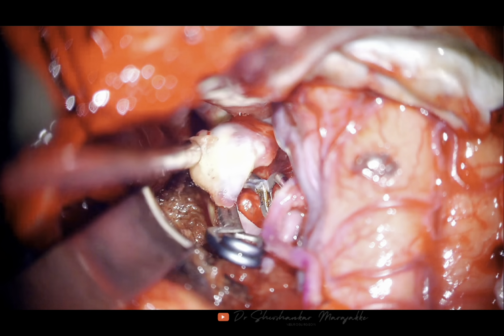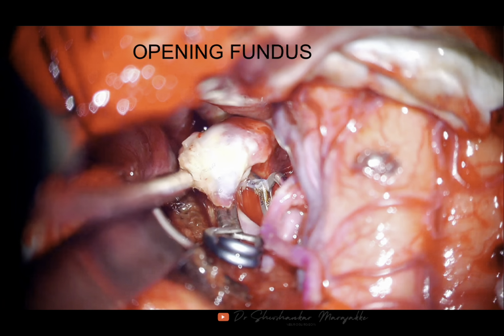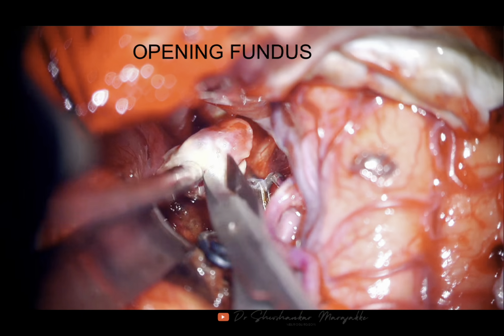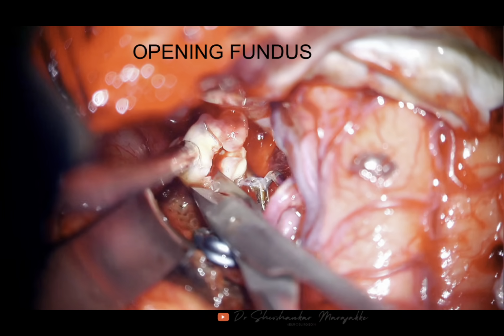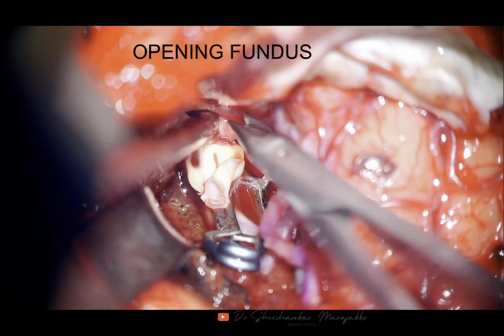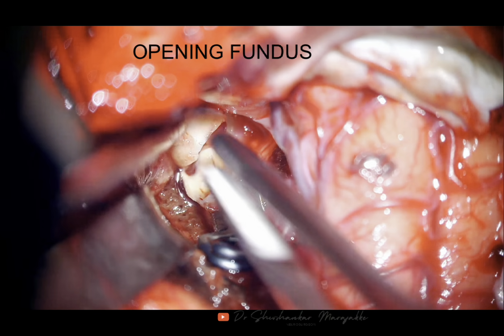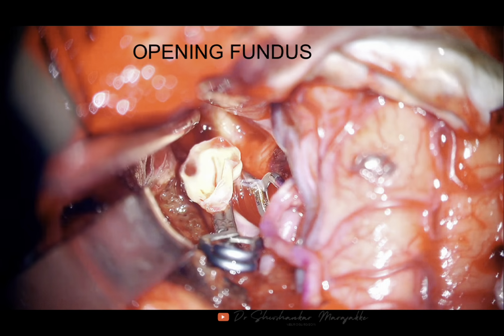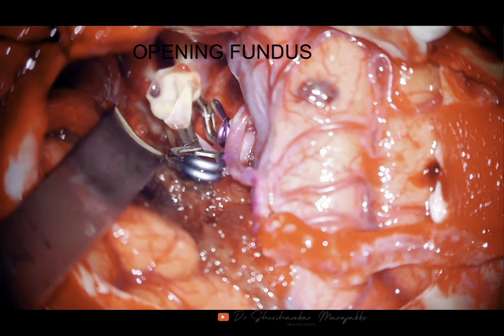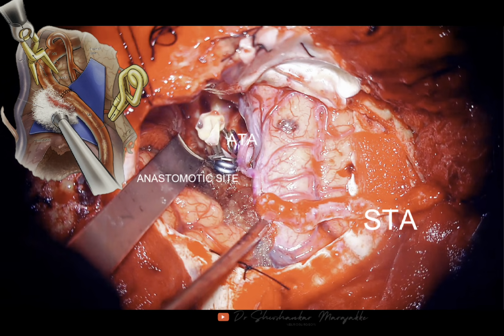Usually in larger aneurysms, we open the fundus of the aneurysm, because sometimes if the neck is calcified, the clips may not approximate it properly, and for that reason the aneurysm might keep filling. In this case, you can see the aneurysm is not filling. It is very much atherosclerotic, and still, with such a thick wall, it has ruptured. So this completes the clipping of the aneurysm.